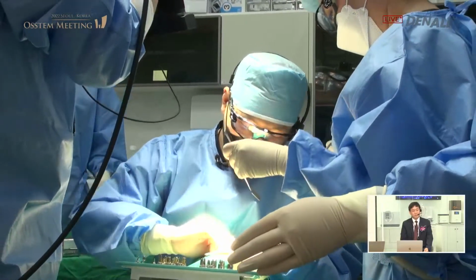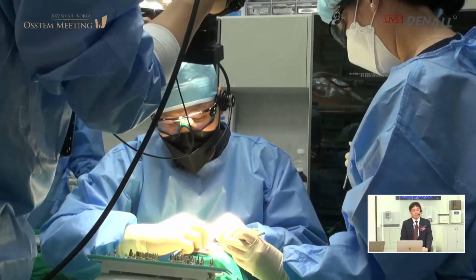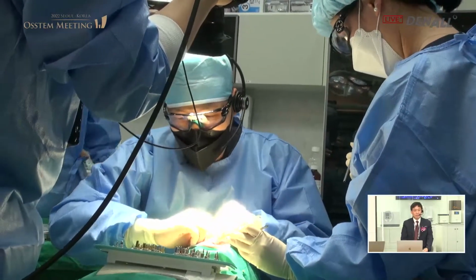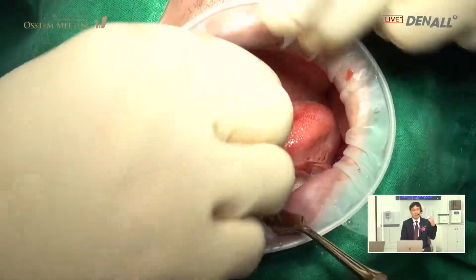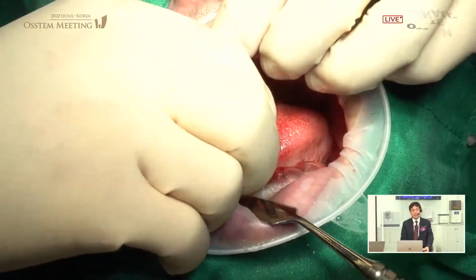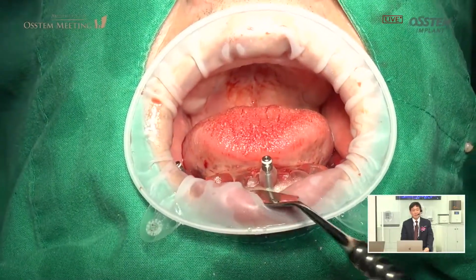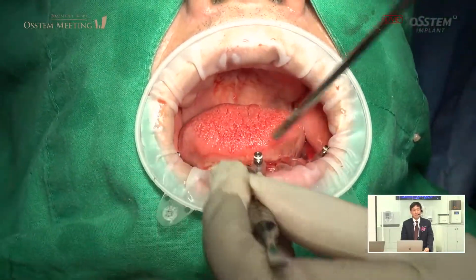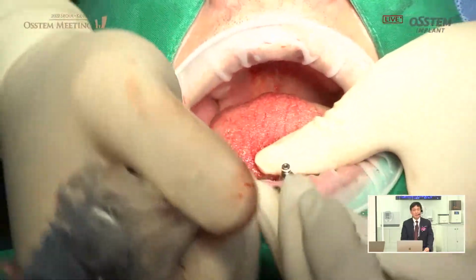On the anterior area, the implant anchors which were used for fixation will be removed. Anchor screw, I'm going to remove the anchor screws.